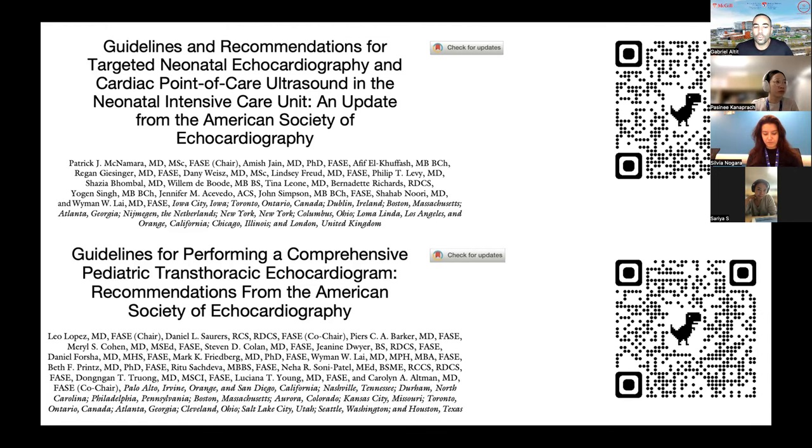In the sense, the way we measure a certain valve has already been done by various cohorts, and they've measured the valve like this. And so that's why we measure the valve the same way, so that we're able to compare ourselves to these previous data sets. Okay, so that's the idea of standardizing.